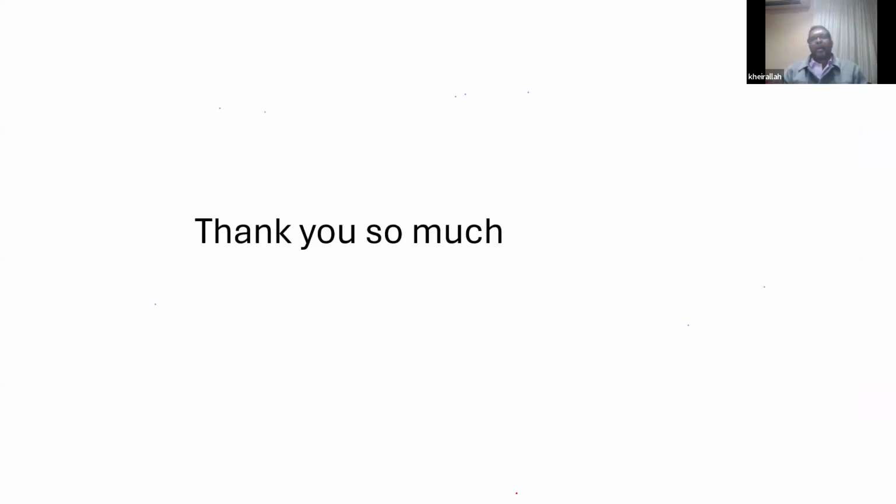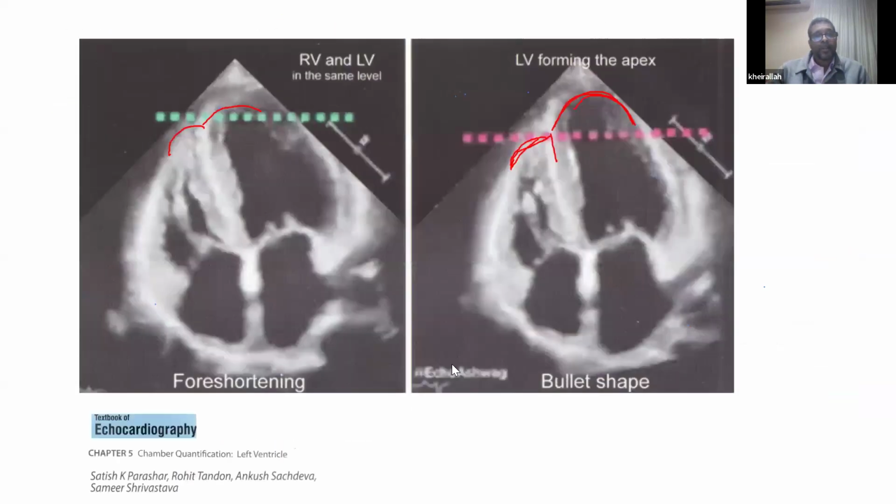Okay? So by this, we come to the end of this presentation, and thank you so much. The most important takeaway from this presentation is the Simpson method, volumetric assessment of the ejection fraction, the one we have discussed earlier.